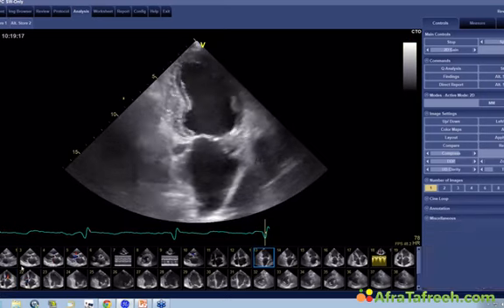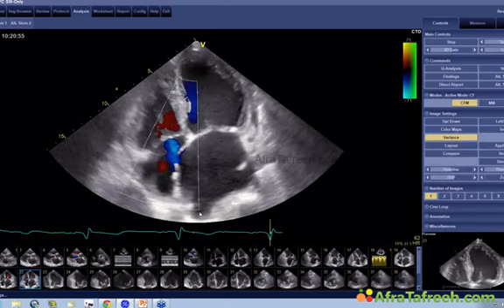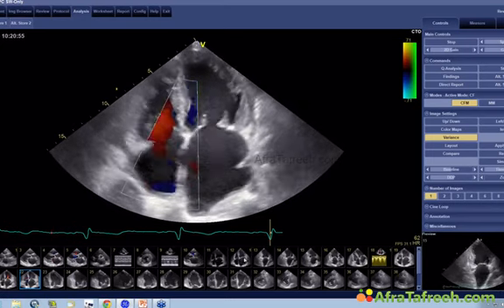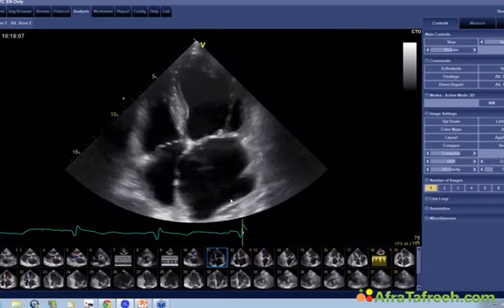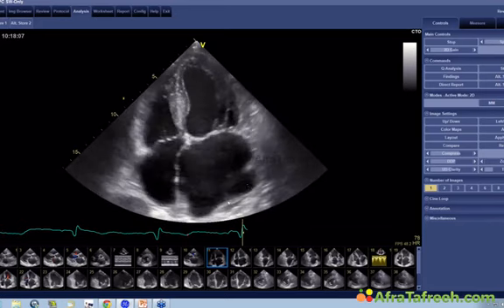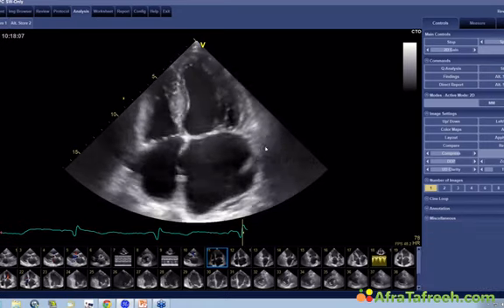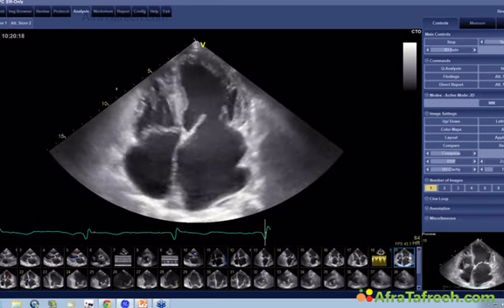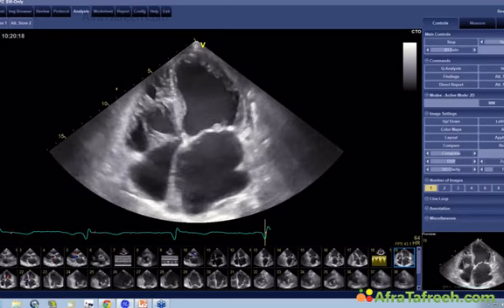The only thing that I was kind of concerned about is this region down here, because in some views I had the impression that there might be a thrombus here. We're thinking about performing a TEE study in this patient to clarify that. Here, this is the region here. Honestly, I think this is just the left atrium we're cutting tangentially, but I cannot exclude for sure that there's not a mural thrombus here. Otherwise, I guess we'll just try to stabilize the patient. Remember, she's 92, and hope that we can just bring her along with medication.